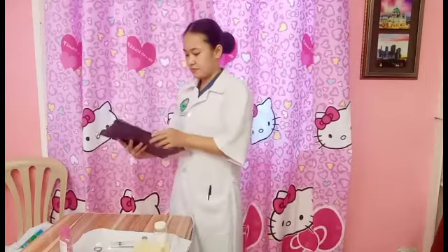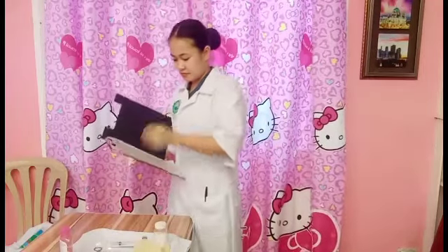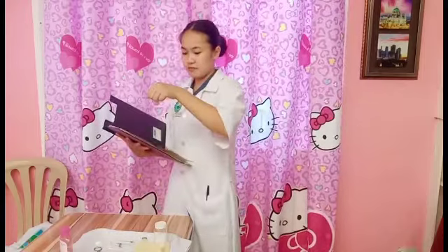Next is to check the MAR or the medication administration record. Check the labels and medication carefully against the MAR to make sure that the correct medication is being prepared. So this is to ensure that the correct medication is being administered to the correct patient.